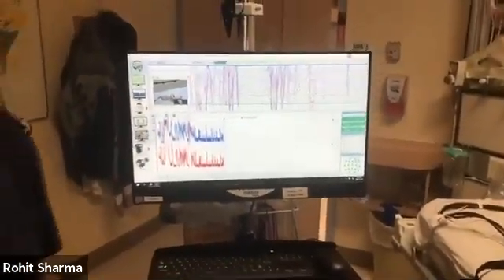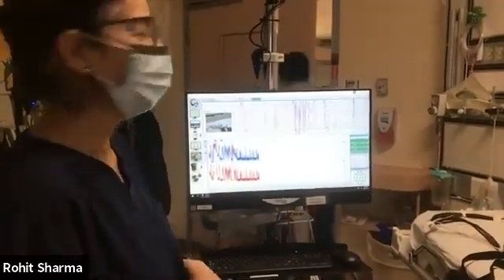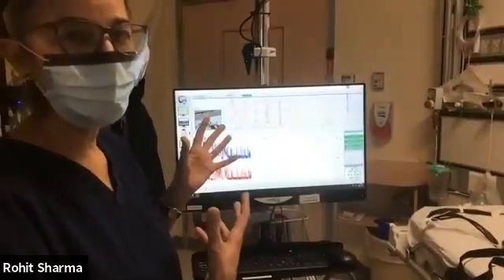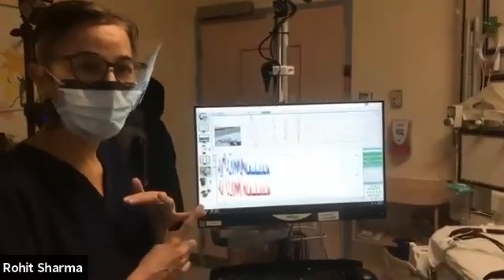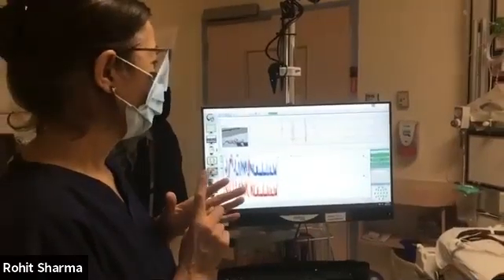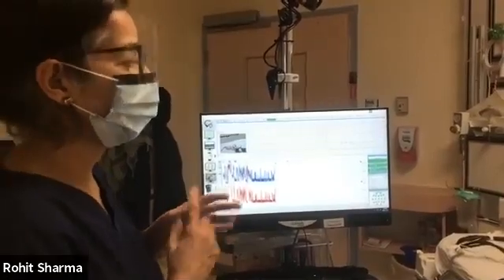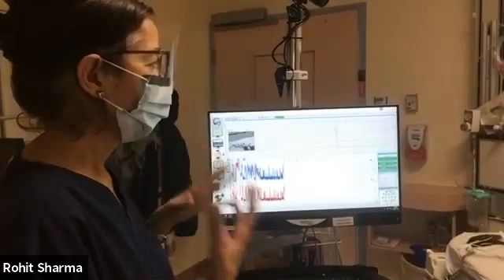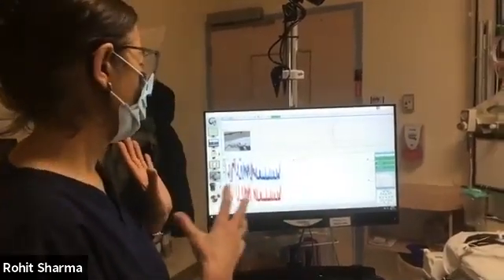Okay, guys, my name is Amrita, like Roy said already, and Cecilia. Welcome to our EEG system that we use here at SickKids. Basically, what I'm going to do is walk through the system with you, how the system works. We're going to cover steps like annotating on the system, how to turn the system off and turn it back on again. And if you're going to MRI or CT or any other procedure, how to disconnect the patient from the machine and take the patient there. And then finally, of course, how to take the wires off and close the system totally down.